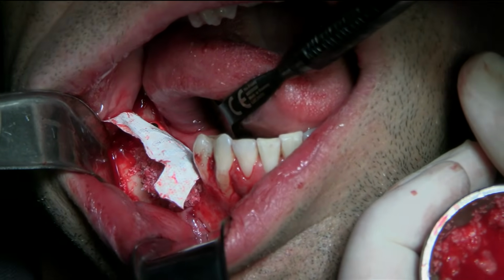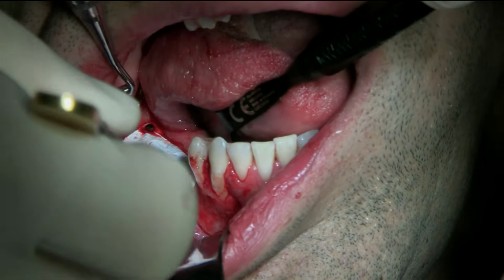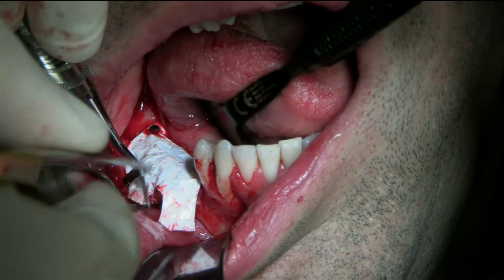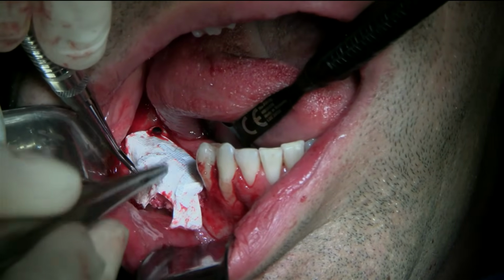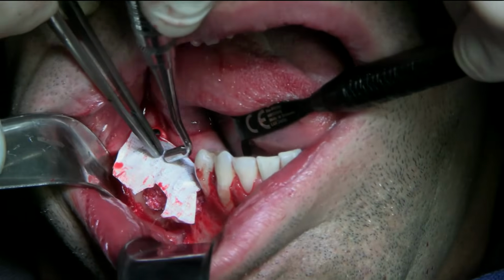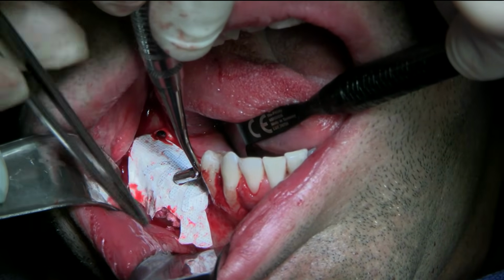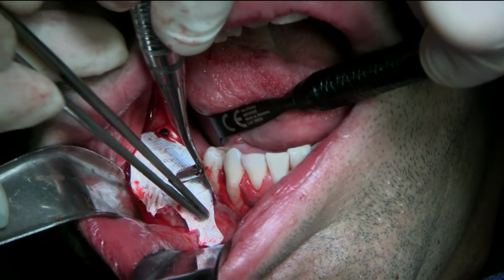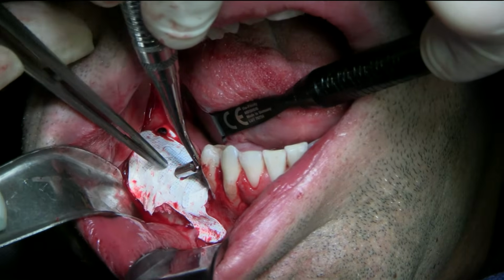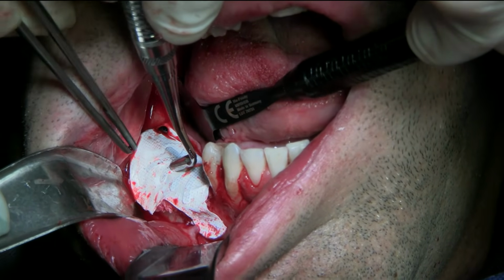So now I can use the membrane just to position the... so you can see how that looks pretty nice.